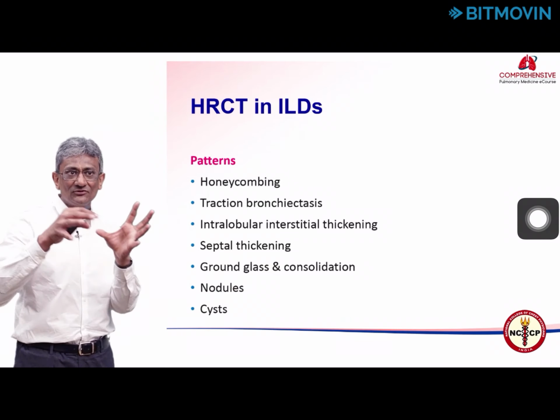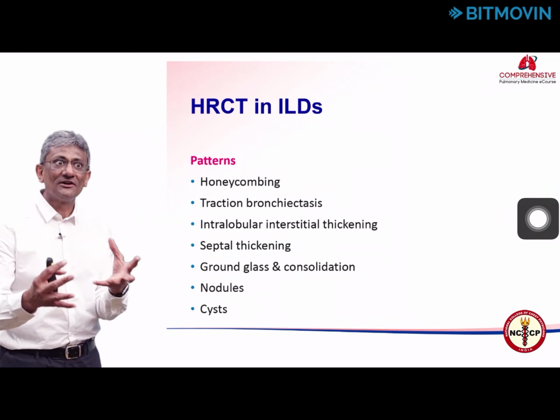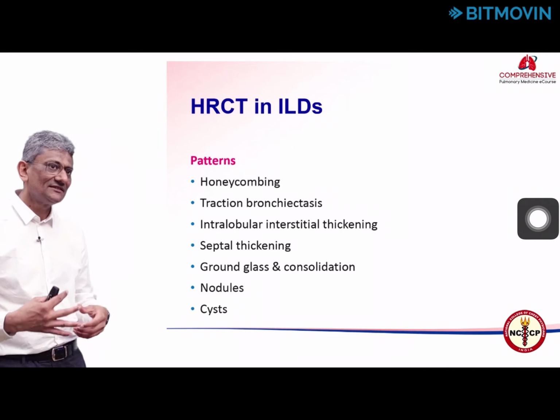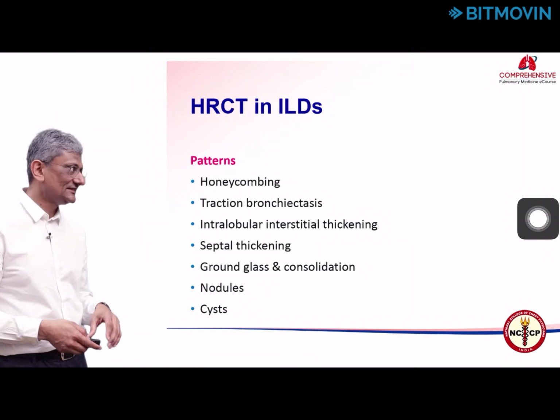And then obviously those patients that require a biopsy, we should be then able to have a biopsy correlation that allows us to get even better at making the definitive diagnosis. So this was the role of HRCT in ILDs.